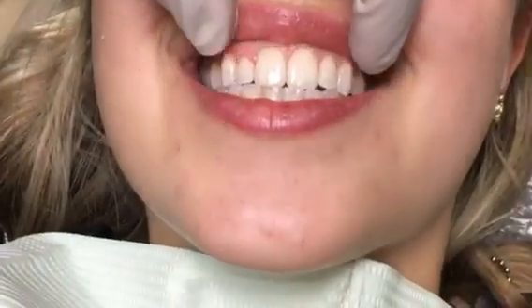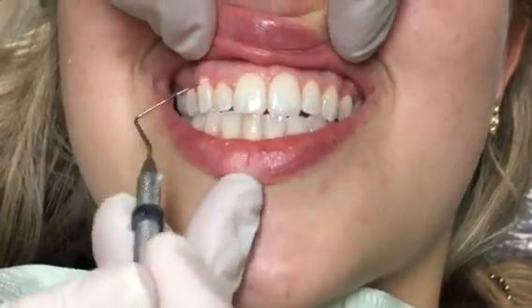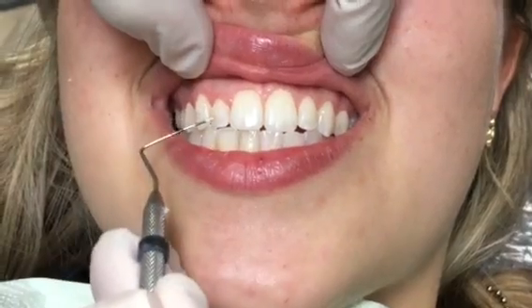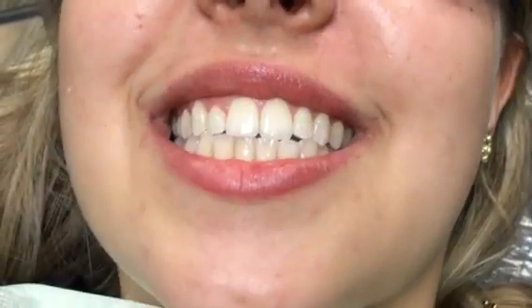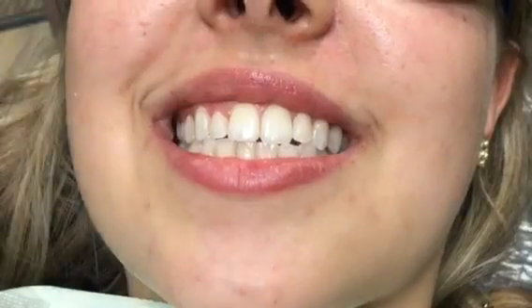As you can see, she has a beautiful smile, but her gum height here is higher than the gum height on this tooth. So when you look in the mirror, you probably, Rachel, think that this tooth just looks too small, right? And you want to create an evenness between your two laterals. So what we're going to do is we're going to take a laser and we're just going to remove some gum tissue. It's done very quickly and very simply. So we're going to wear our protective eyewear and go ahead and show you how we do this.